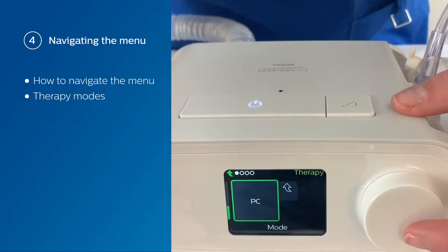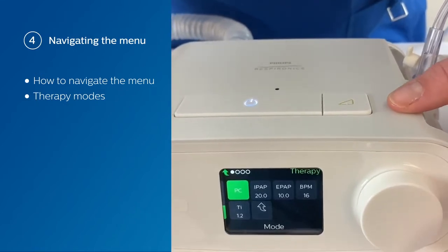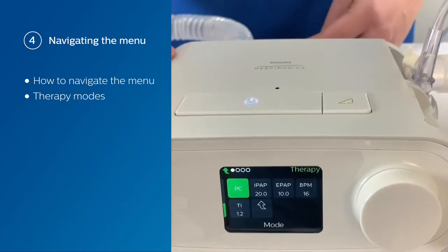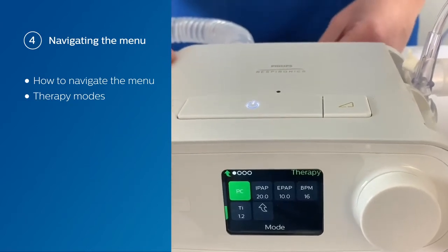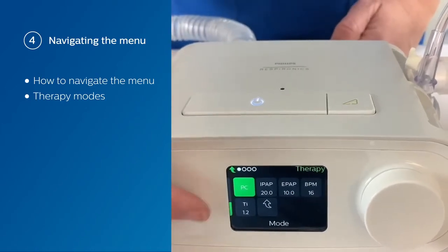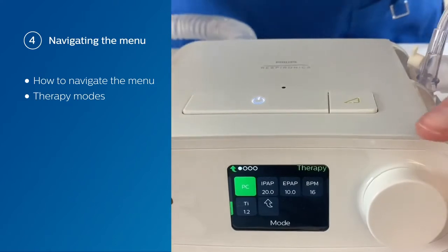And finally, in pressure control mode, you set an IPAP, an EPAP, a breath rate, and an inspiratory time. The breath rate is the minimum breath rate you get throughout the entire minute, and every breath is at the set inspiratory time.